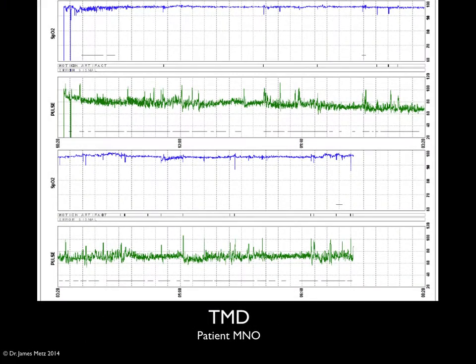You'll see that the heart rate is dramatically active, and that's not normal. I feel when you're looking at a TMD patient that has a heart rate of this amount of change overnight, they're going to be tired during the day. They're going to exhibit many of the symptoms that a sleep apnea shows, but yet they're not considered to be sleep apneic.